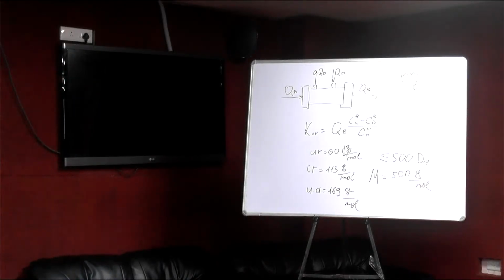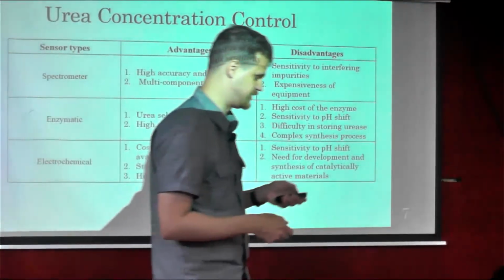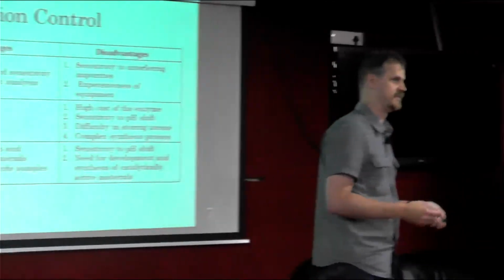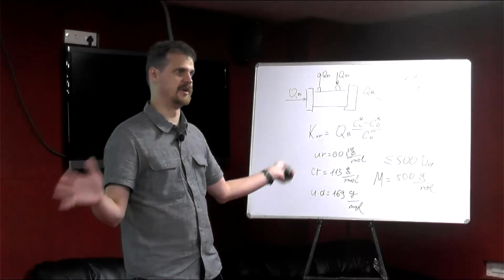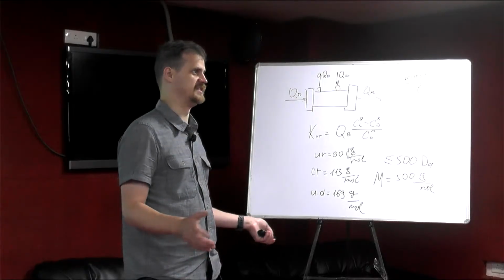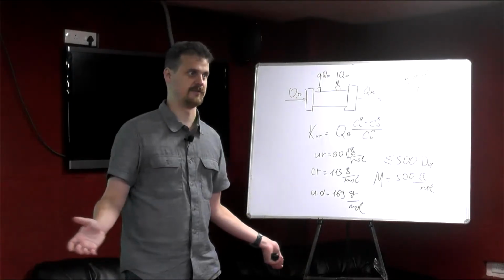And why urea is such a prominent marker in conventional dialysis is because it's usually very easy to obtain the sample and to measure the urea concentration, for instance, by enzymatic method. There are multiple approaches to measure urea, and it does not require very expensive equipment like chromatography.